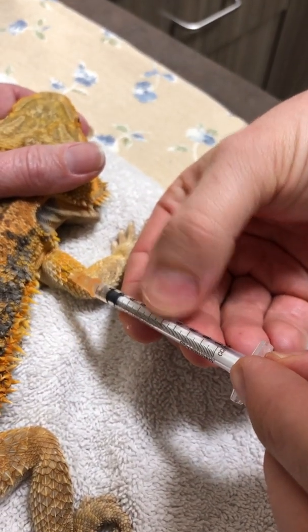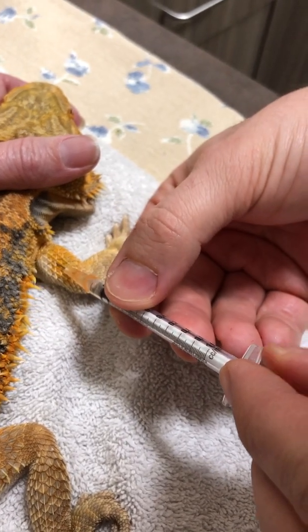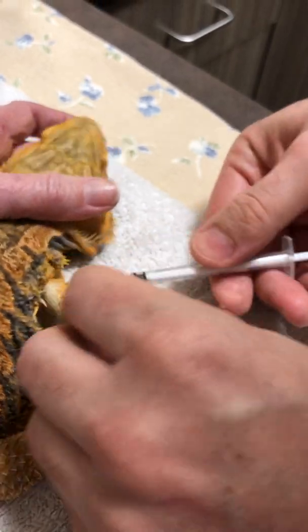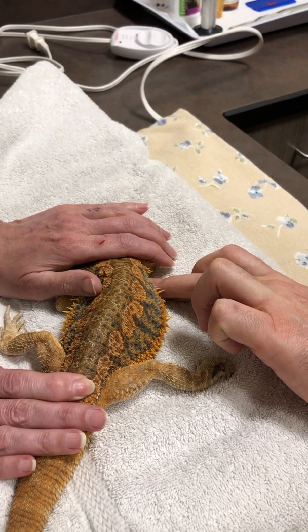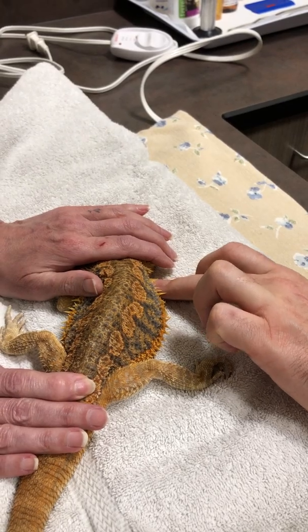Pull back on the needle and make sure there's no blood coming back, and no air bubbles coming back in there, and then inject. Come out, put a little bit of pressure on that area to stop the medication coming back out, hold it for a few seconds, and then we're done.